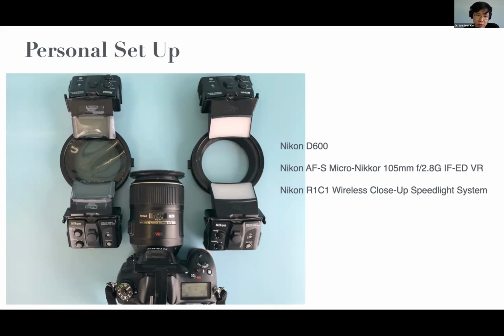And if you see here on the screen, on my camera, there is U1 and U2. U1 is a user setting. You can have presets where you put all your f-stops, shutter speed, ISO, and color space in there and save it. So when I walk in, I always take the photos with this polarizing filter first, which is under U1. Then I take this off and put this on, and put it under U2 and take pictures, which makes it a lot more efficient. I don't have to play around with putting on the filter and adjusting my angle and whatnot. You just take it off, it takes 1 second, and then you put it on, turn the dial, and you're good to go.